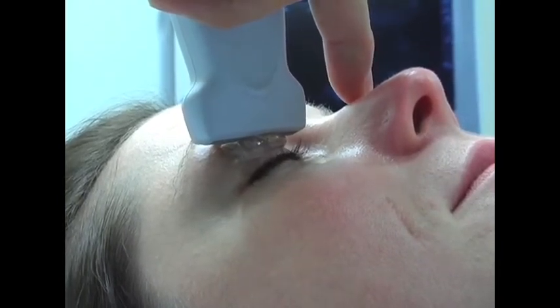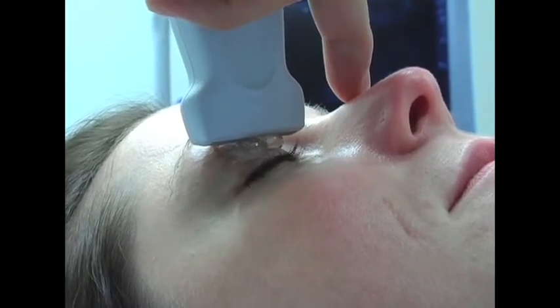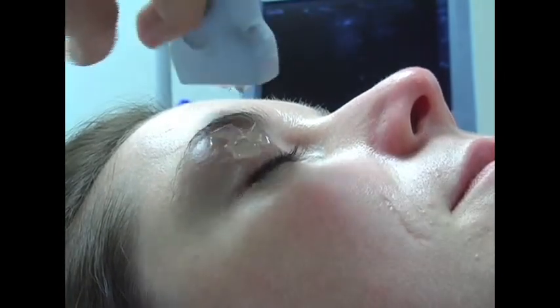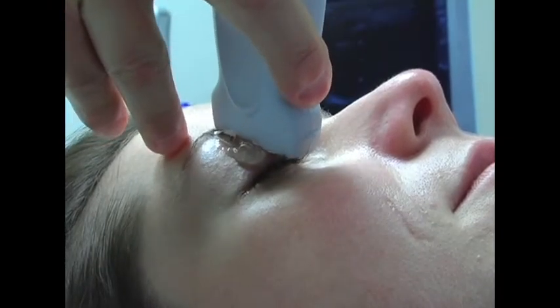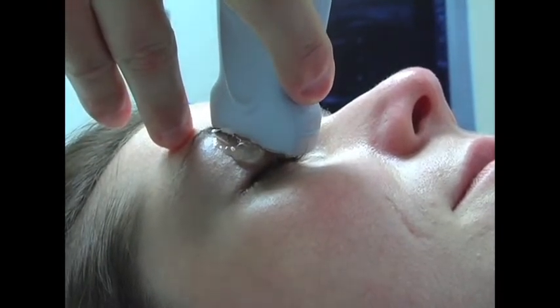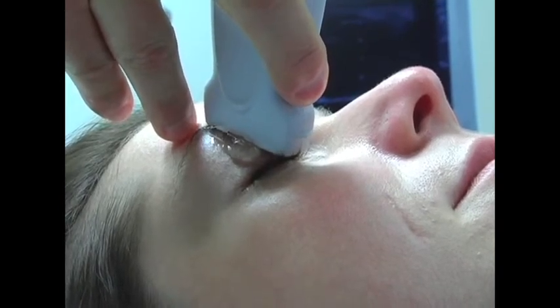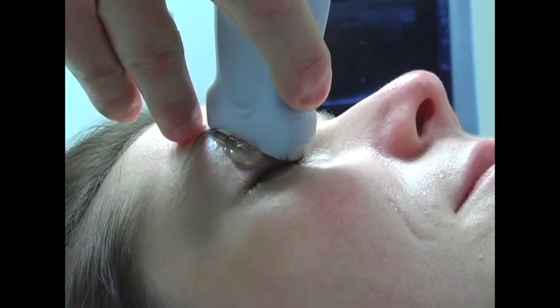Most information can be obtained in the transverse orientation. However, rotating the probe clockwise 90 degrees will give you a sagittal view of the globe with additional information. This is especially helpful when evaluating an eye for foreign body. In the longitudinal position, artifact may be seen on the ultrasound secondary to air in the eyelid slit.